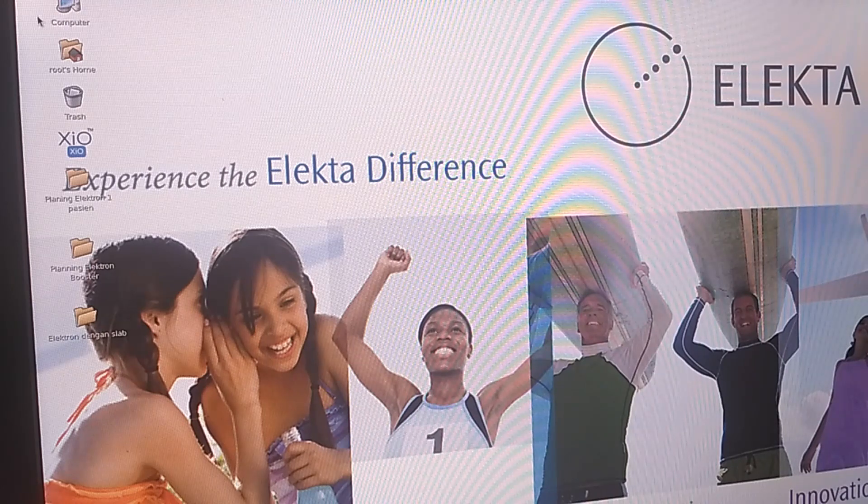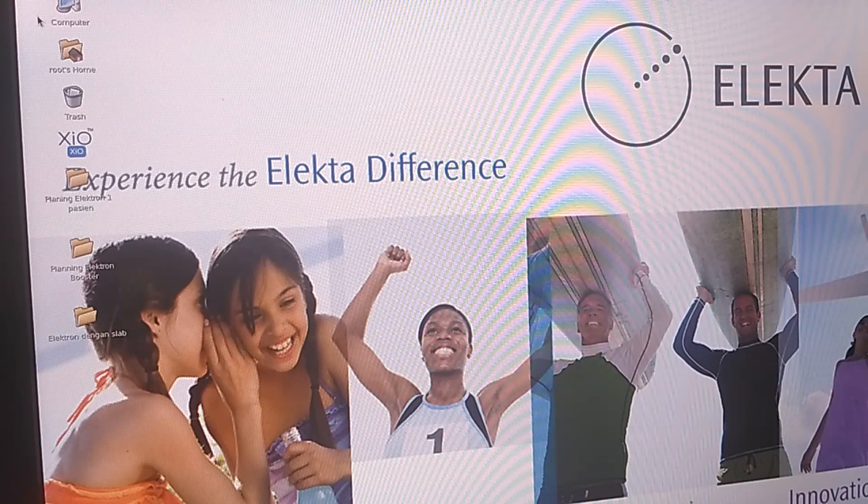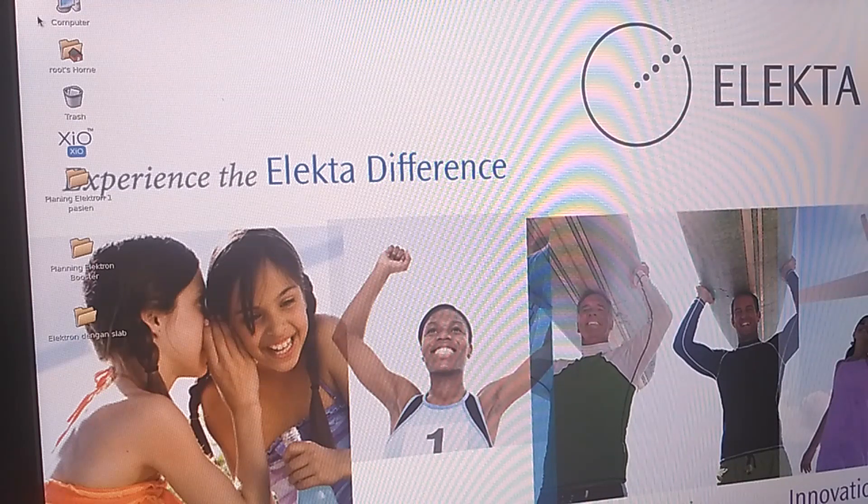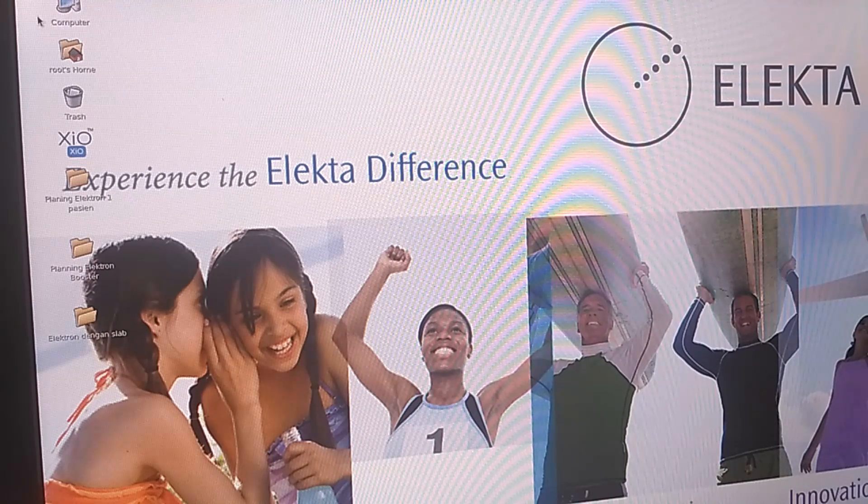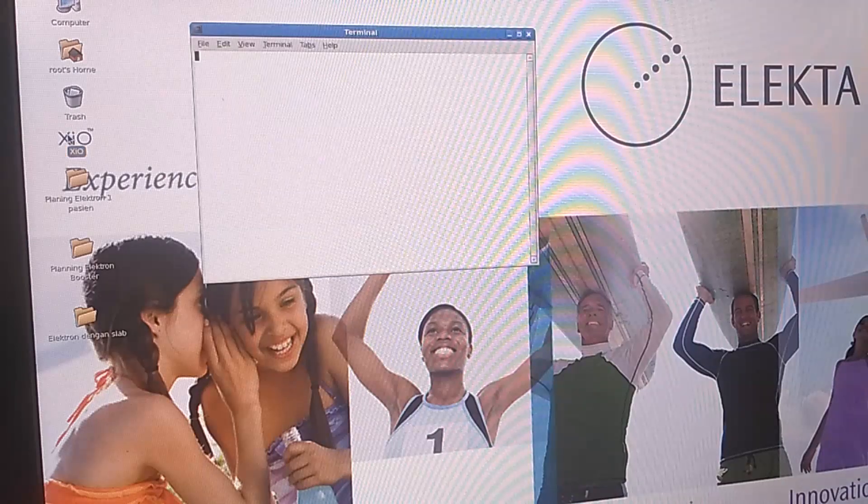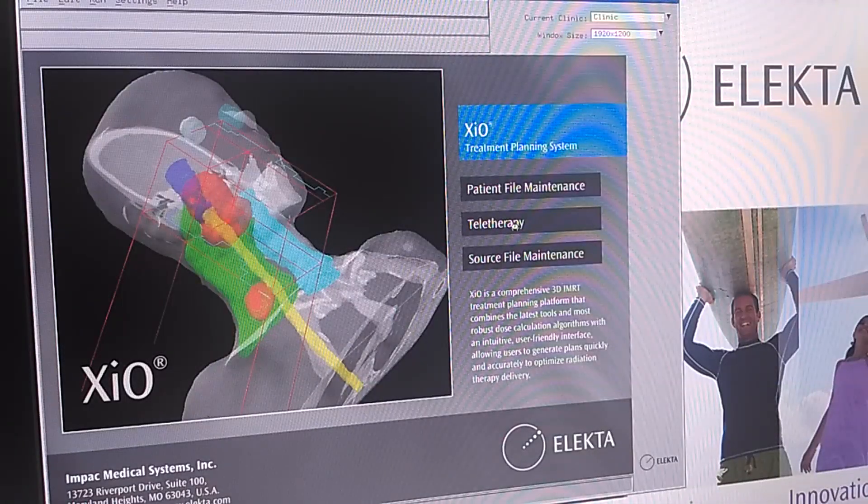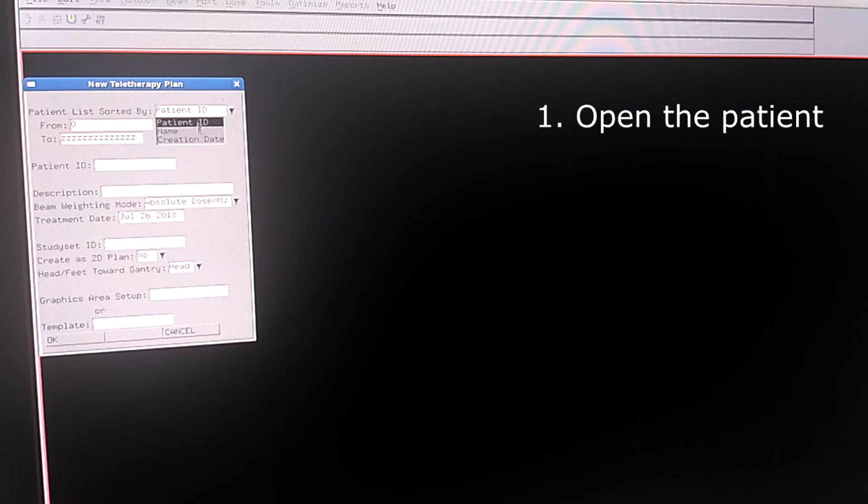In this video, I am going to show you how to plan a 3D CRT electron beam planning. The TPS I am using is XiO. First we are going to open it and we choose the patient.